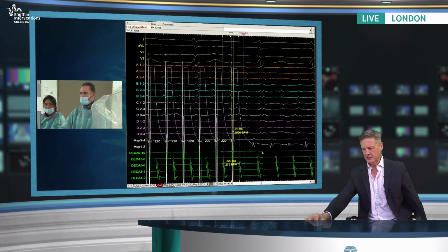Jan, you were going to say something earlier on. Now, just thinking about the right atrium, obviously outside of the atrial flutter, I was just going to ask you, Richard, also Ross, and obviously also Hugh and Aldo, ultimately, if you want to chip in, what patients are you thinking about the right side? Obviously, except the CTI. Vena cava, superior vena cava. What are your thoughts in persistent AF on the right side of lesions?